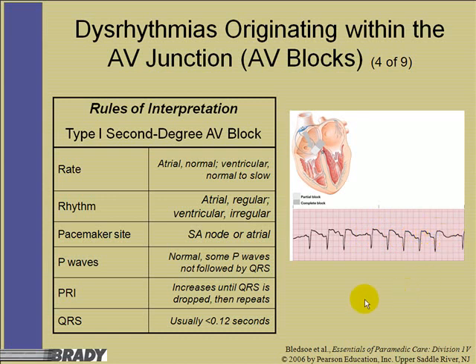So the way I could remember this through school is, since it's Wenckebach, another name that we use for type 1 second degree, we say longer, longer, longer, drop. Wenckebach. That's just one way to remember that term, but it's type 1, second degree.